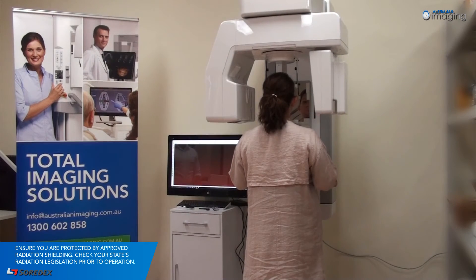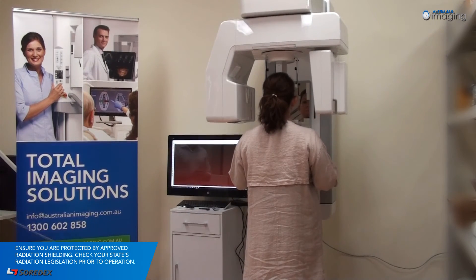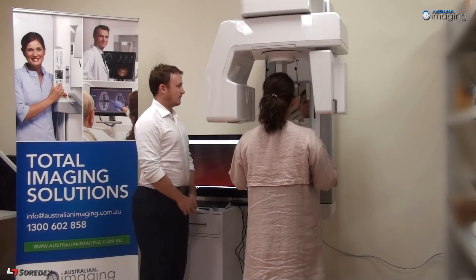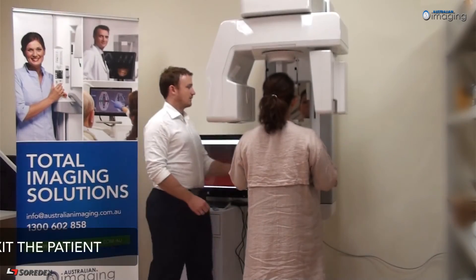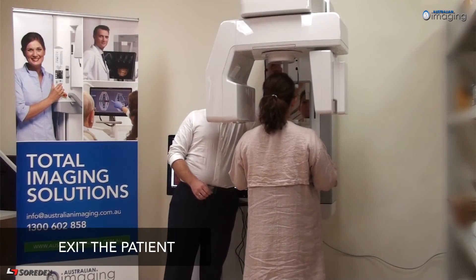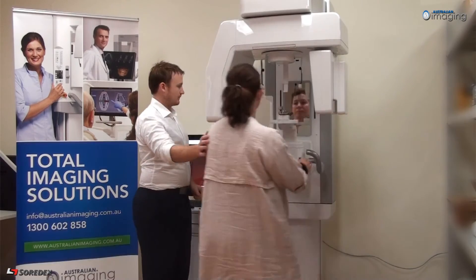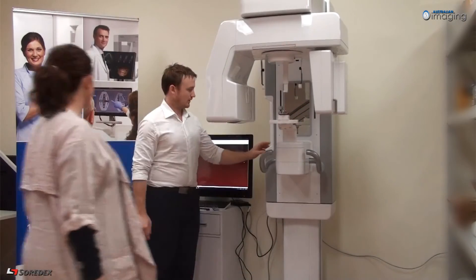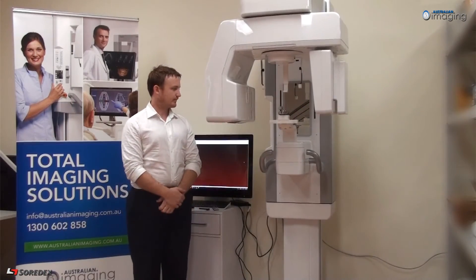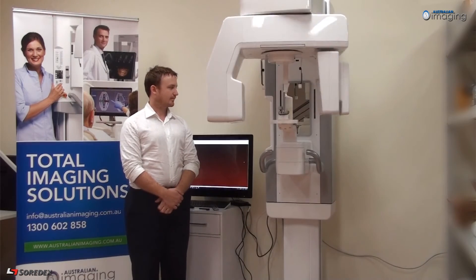Your image will automatically be available for analysis in On Demand. After the exposure has been taken, the unit will pause in the patient exit position. Release the patient from the machine and then press the return button to revert back to the start position.